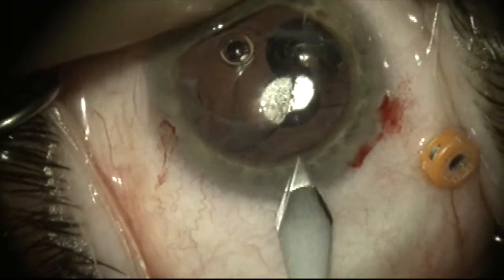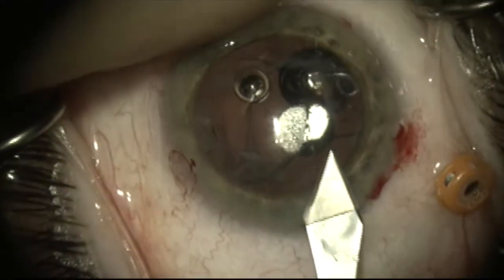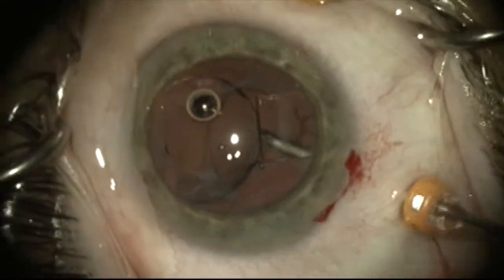Here I've filled the anterior chamber with dispersive viscoelastic to protect the cornea and placed pars plana trocars. I'm now making my clear cornea incision. A 23-gauge pars plana vitrectomy will be carried out here.